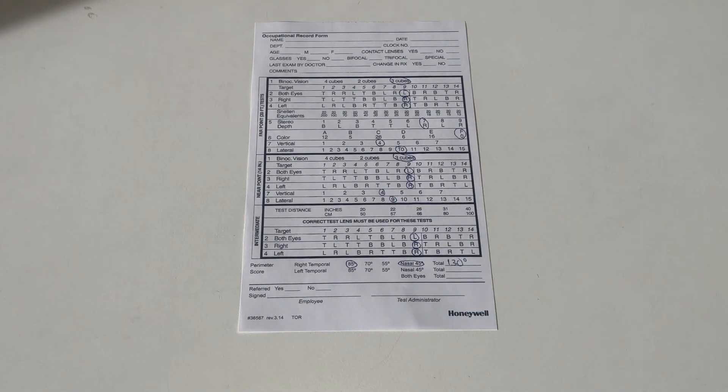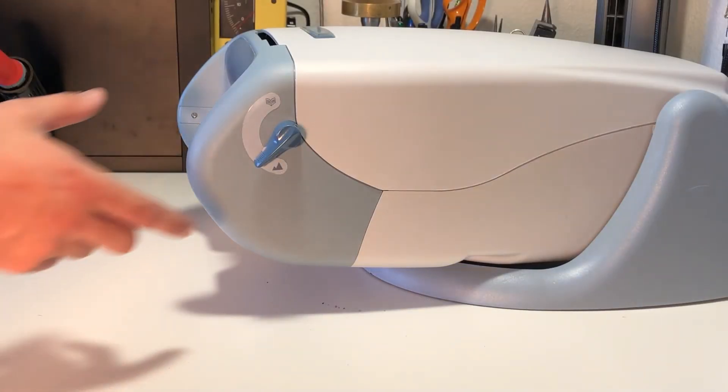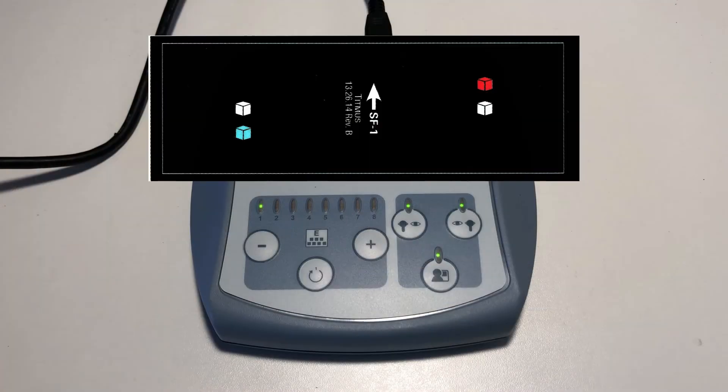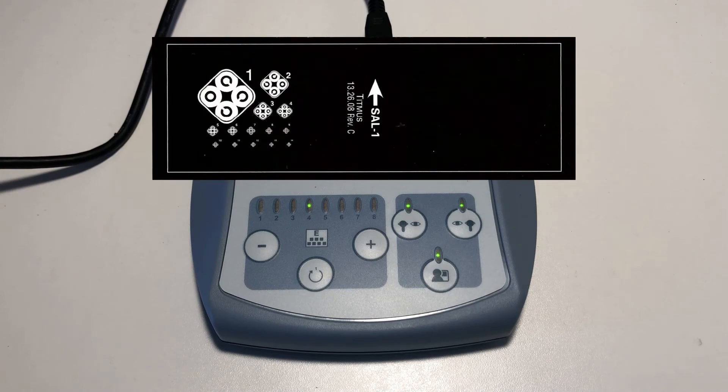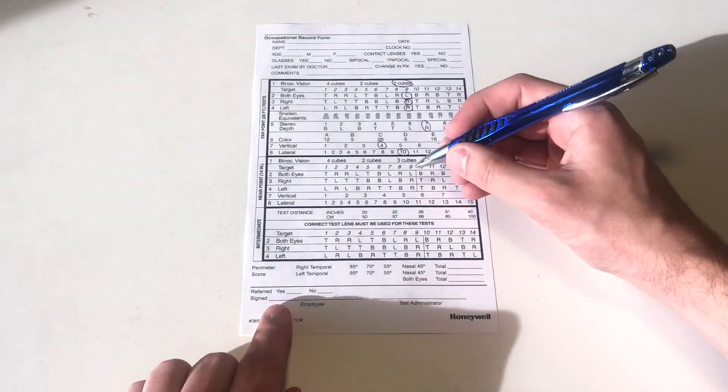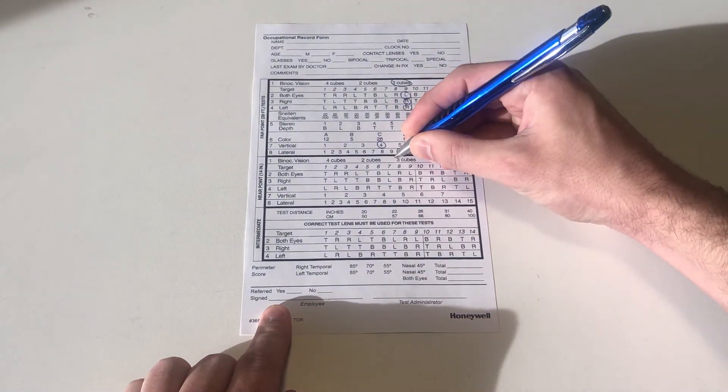Now we will move on to the near point portion of the test. Move the near-far lever to the near position and repeat the procedure for slides 1, 2, 3, 4, 7, and 8. Record the results in the near point box of the record form.